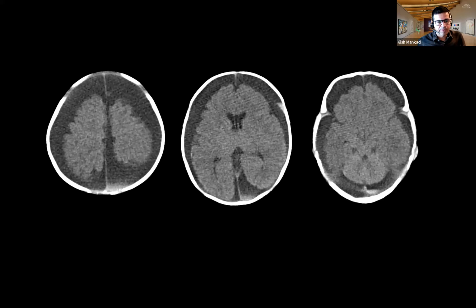And in glutaric aciduria, what you typically get is underdevelopment of the frontal temporal lobes, open operculum. In the crisis situation, you can get density and signal changes within the basal ganglia structures. It is rare. It is much, much rarer compared to the context of abuse. And abuse from multiple aggressive shaking is what we are talking about here.